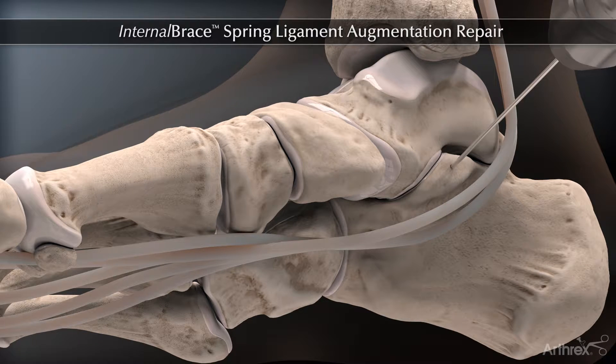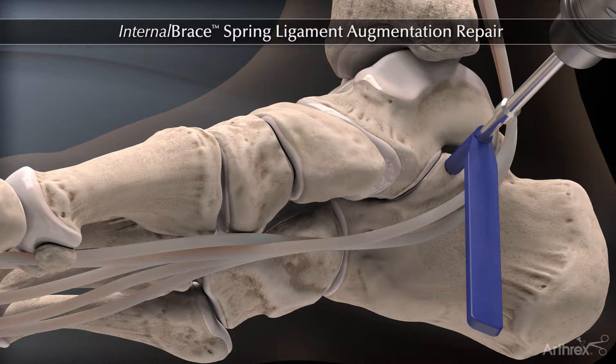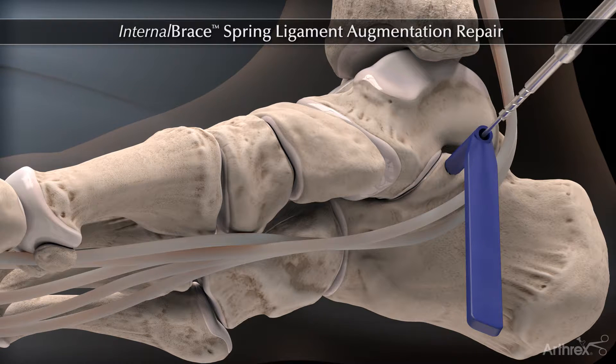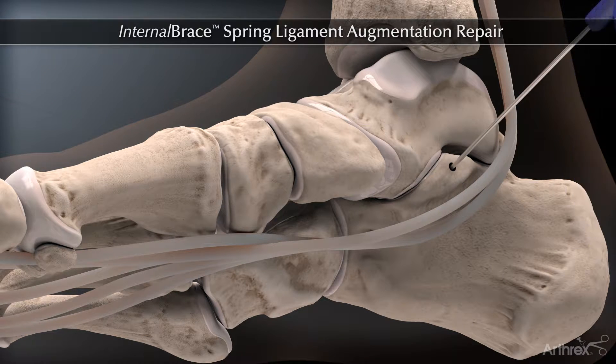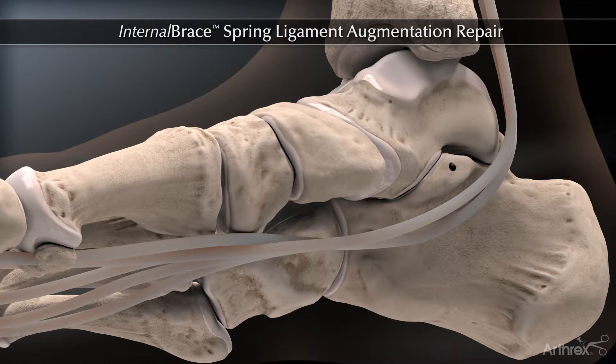The first step of the procedure involves drilling with the 2.7 mm drill and tap. With the 3.5 mm tap at the sustentaculum tali of the calcaneus, it is important to make sure that the drill is angled 15 degrees plantarly to avoid penetration of the subtalar joint.